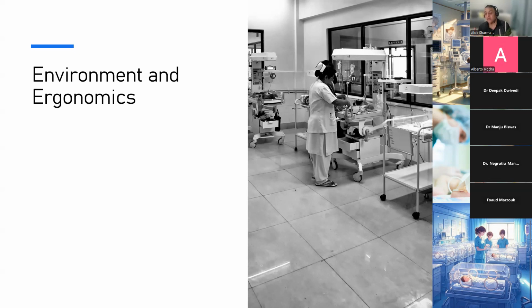They don't have a scanner on the actual unit, but they have a dedicated room on the unit where the radiologist sits to do that, so that they don't have to take the baby all the way to radiology. So again, you have to decide based on your ergonomics how best to do scans. We never move babies. We do our own scans. It's neonatologist performed.